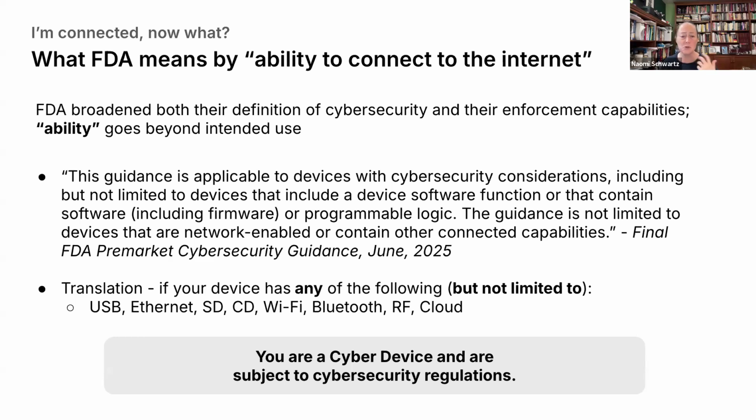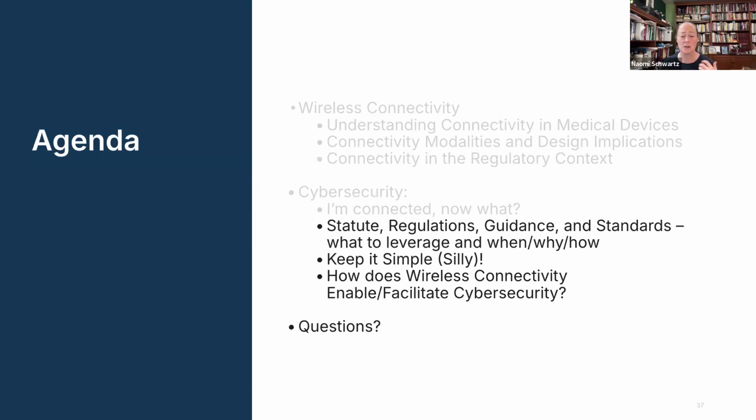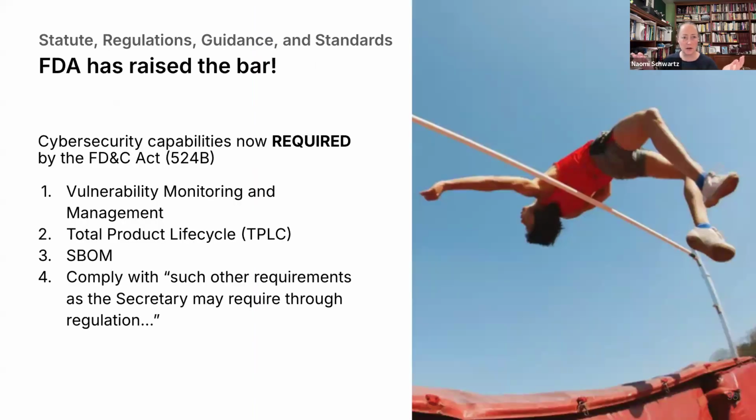So if you're a cyber device, you're subject to cybersecurity regulations. And more specifically, you are subject now to statute. So what's the difference here? The highest bar in US law is statute. That is what is written into the actual Food, Drug, and Cosmetic Act. For example, Section 524B of the Act is statute. Those are requirements. They say you shall, period. Don't argue, just do it.